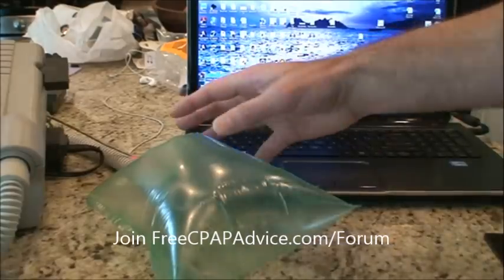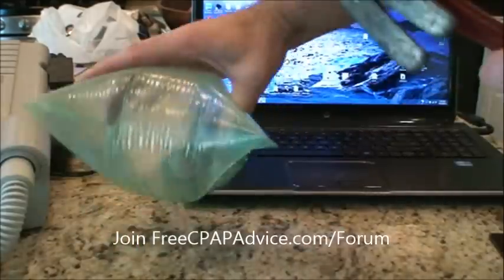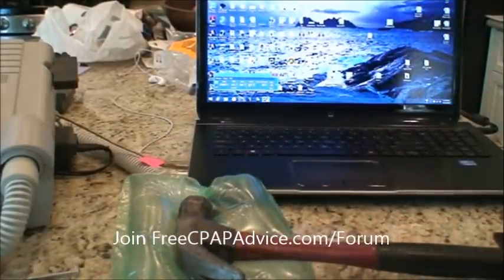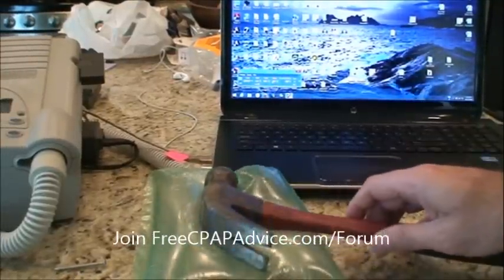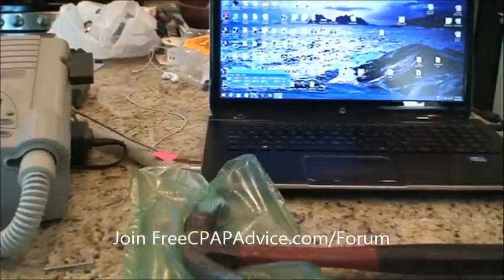All right, so let's go ahead. We're going to add apnea, and that's going to be a hammer. If this is the upper airway nice and big and full and open, then this is apnea. This guy's got a huge uvula. So technically, even though CPAP is turned on, this is not CPAP, right? They have nothing on, they have apnea. They're trying to breathe and it's just completely collapsing. Okay, so it's completely collapsed.